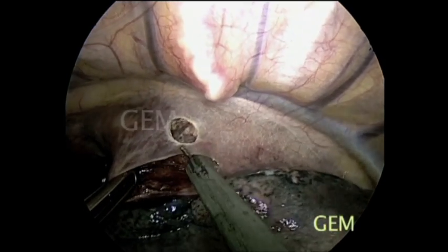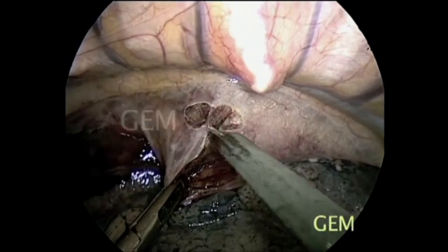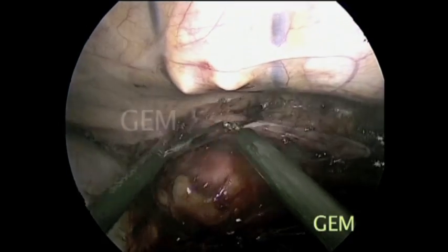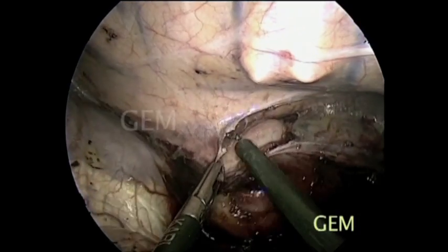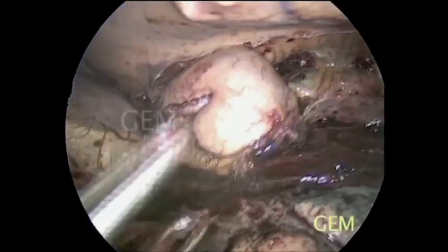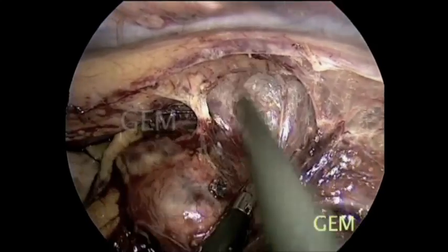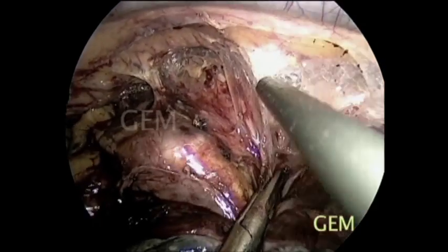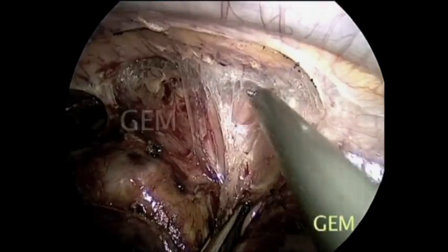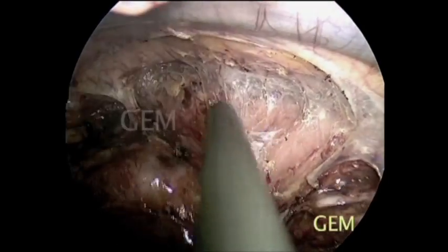Now in the semi-prone position we start mobilizing the mediastinum. You can appreciate the vertebra; the patient is prone and slightly semi-prone. For beginners, if necessary you can open the chest. We can visualize the aorta and thoracic duct. Here we have divided the esophagus.